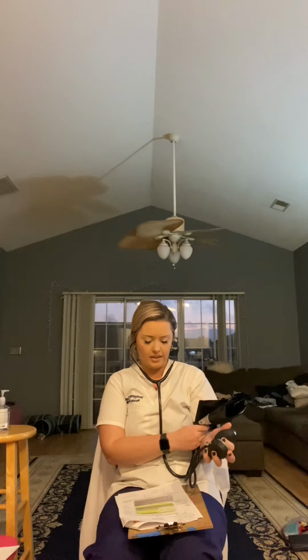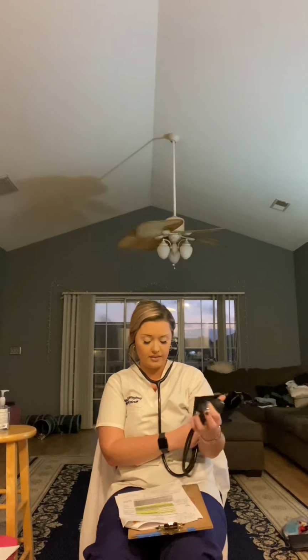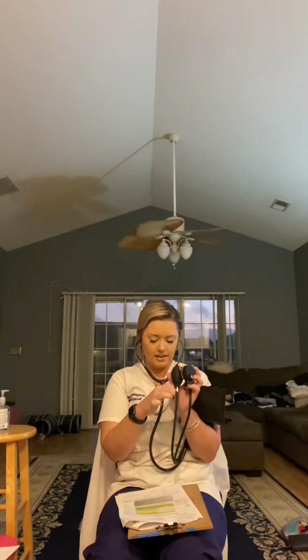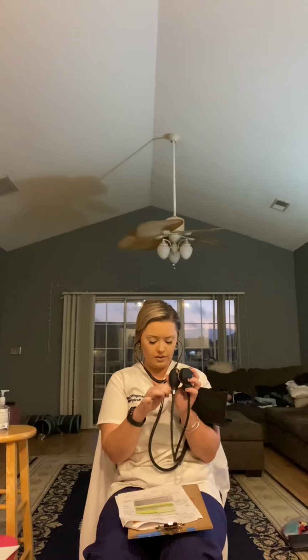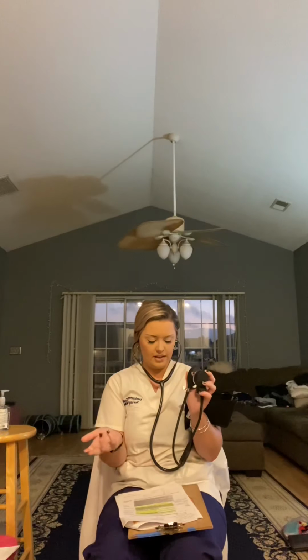and I would inflate it to that maximum level, and then I'd begin, after I reach that level, I would begin deflating it by opening this little valve right here, slowly, and a deflation rate of about 2 millimeters per second. And then the systolic pressure is the point at which I first hear the faint, clear sound that is audible, and the diastolic is that with the sound I no longer hear. And in this reading, I will have gotten 110/70 for the blood pressure.